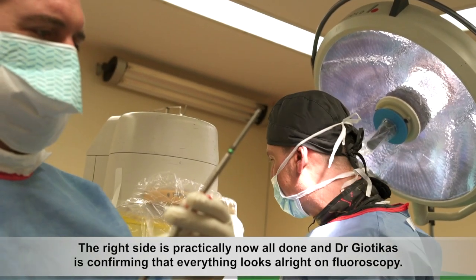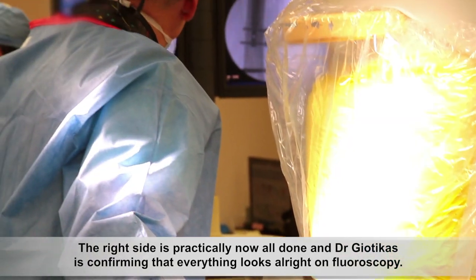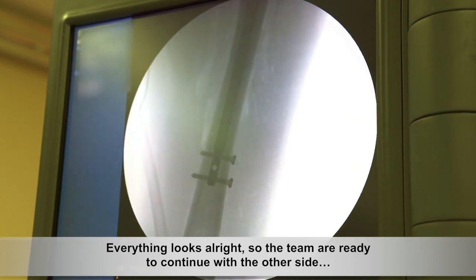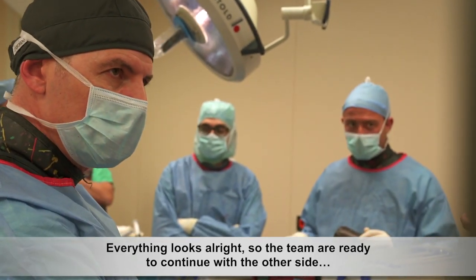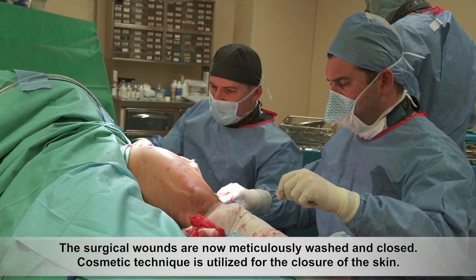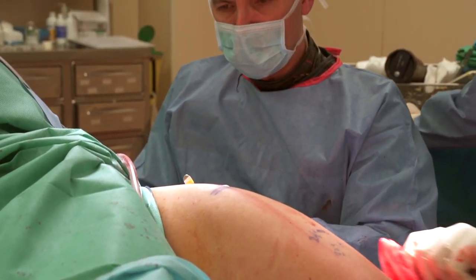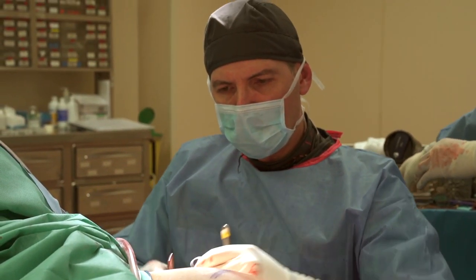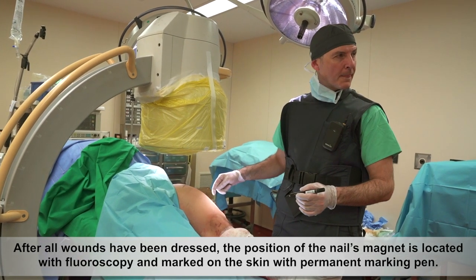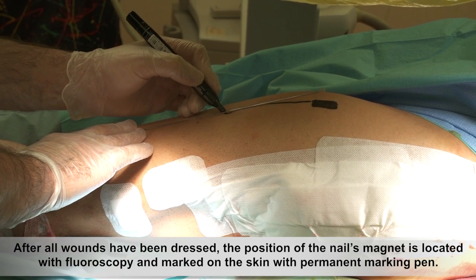The right side is practically now all done and Dr. Giotikas is confirming that everything looks alright on fluoroscopy. Everything looks alright, so the team are ready to continue with the other side. The surgical wounds are now meticulously washed and closed. Cosmetic technique is utilized for the closure of the skin. After all wounds have been dressed, the position of the nail's magnet is located with fluoroscopy and marked on the skin with a permanent marking pen.